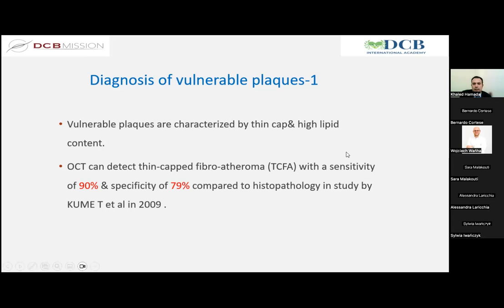Okay, the calcium nodule, I think. Yes, the nodular calcium. Correct. You said it right. The eruptive calcific nodule. We had one very interesting case during a live case I had in Indonesia 2 weeks ago. We were addressing a highly calcific LAD. We managed that, but we did the OCT and we observed by chance an eruptive calcific nodule in the left main. So correct. Please go ahead.